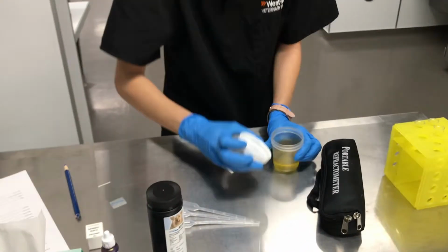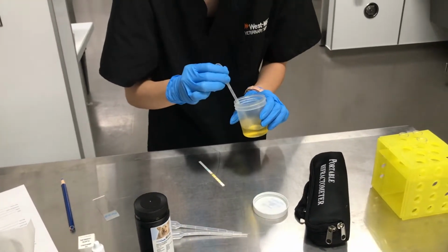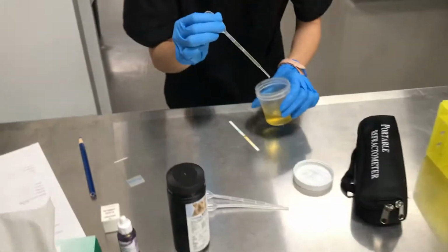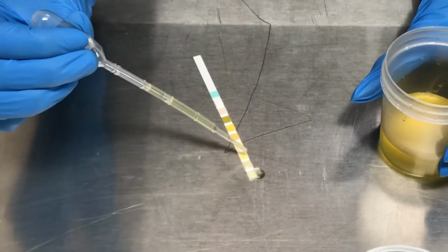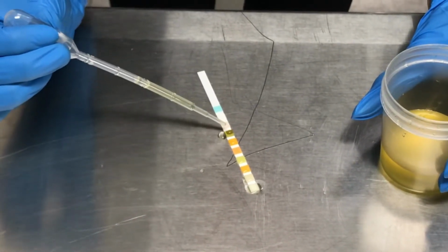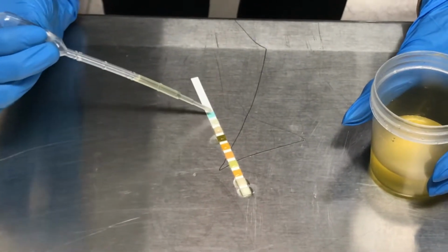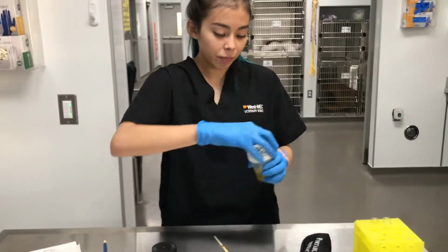And I will collect urine with a pipette and add a drop onto each square. And then I will dispose of this pipette after it's done being used.